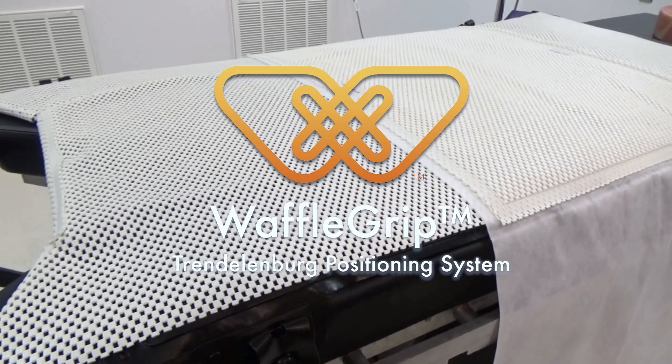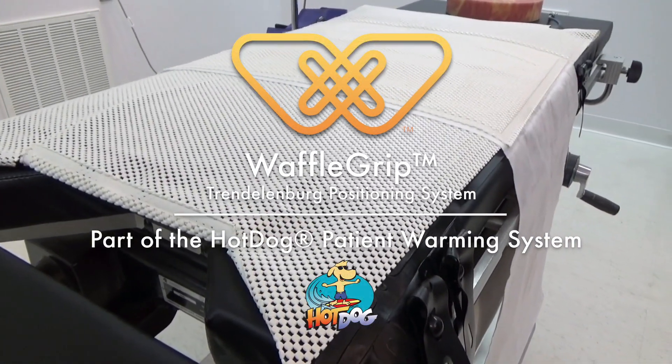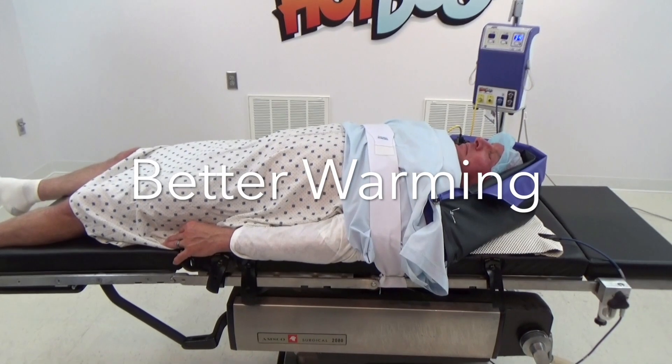Waffle Grip Positioning System for Trendelenburg, part of the Hot Dog Patient Warming System — the only heated grip solution for Trendelenburg positioning, providing better warming to help prevent the adverse effects of hypothermia.